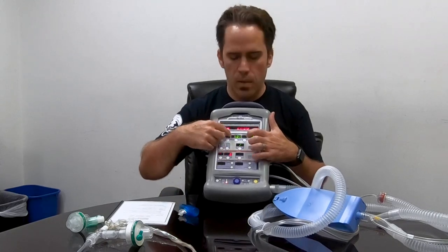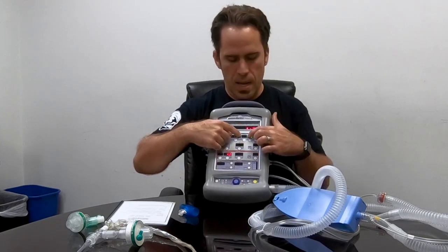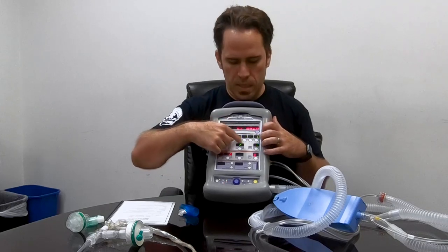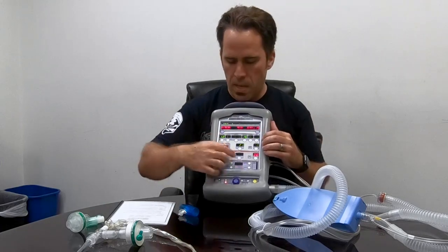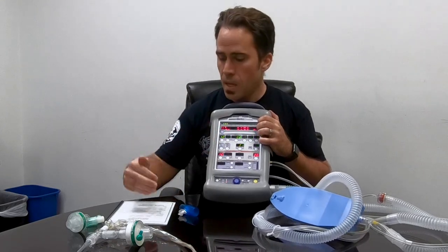Next, I take the breath type down to PRVC. Right now it's in volume mode — whatever volume I select, the ventilator delivers regardless of pressure. I can also pressure-ventilate where it gives a set pressure of 15 cmH2O regardless of volume. PRVC — pressure regulated volume control — mashes those two together: I type in the volume I want and the machine tries to deliver it using the least pressure possible. That's really nice for our patients.